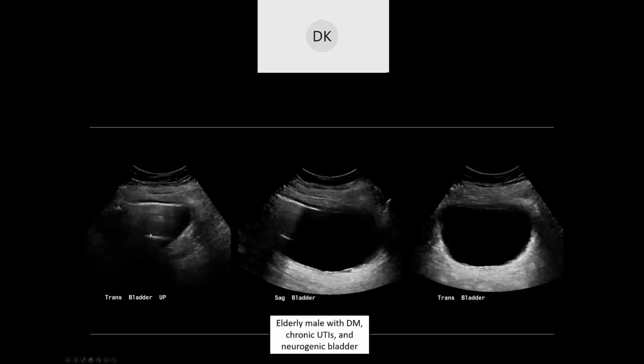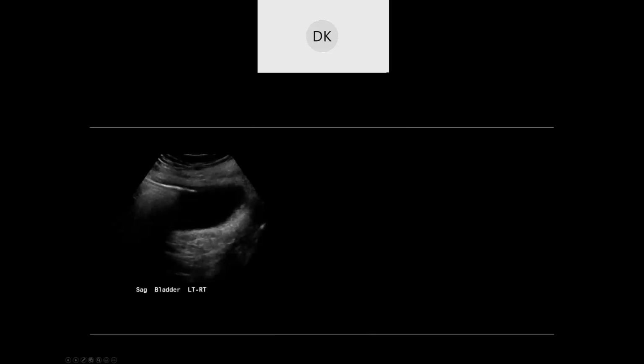It looks a little bit linear. And we could see that a bit better on this cine clip, how it's very linear and almost seems to be isolated to the wall, right? Here's the wall here, and the gas kind of appears to be located within that wall.